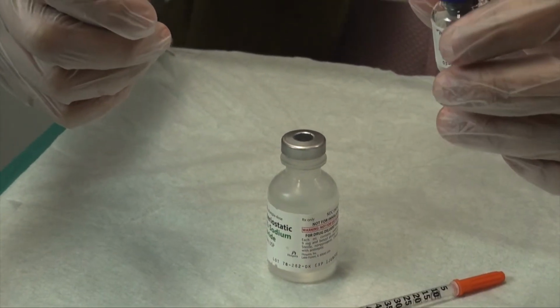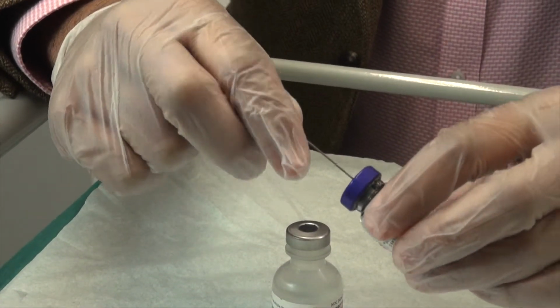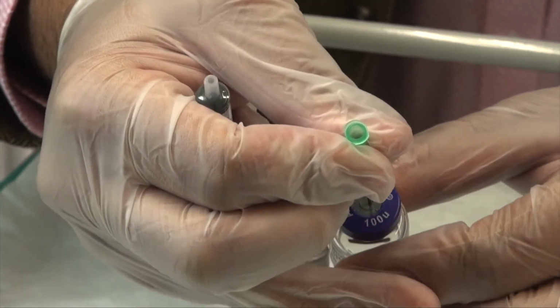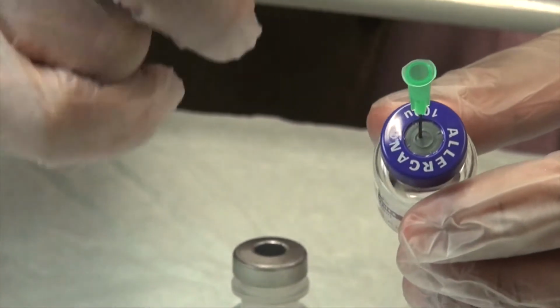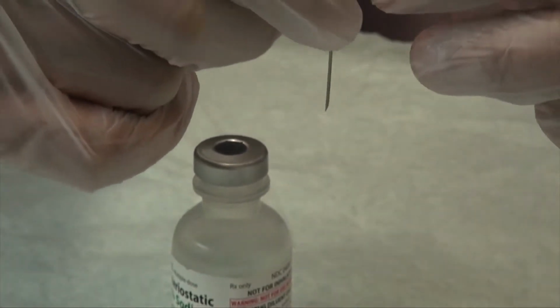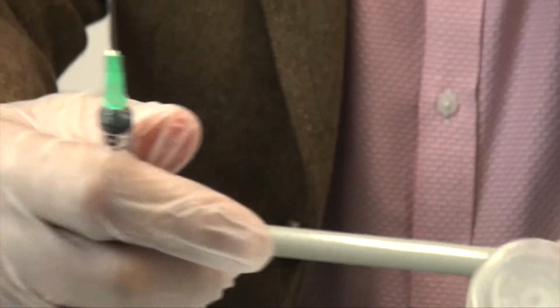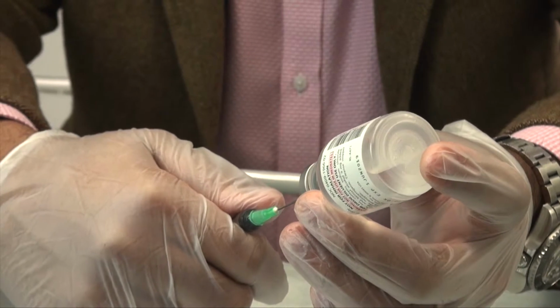Before I put anything into the vial, I break the seal of the vial with the needle itself. What you will now hear is a hiss. This hiss, first of all, reassures us that this vial hasn't been tampered with, and the hiss itself was air from the atmosphere going into the vial. The vial now is at atmospheric pressure. The reason why I do this is to prevent the saline being sucked rapidly into the vial and causing a large amount of foam to be formed.